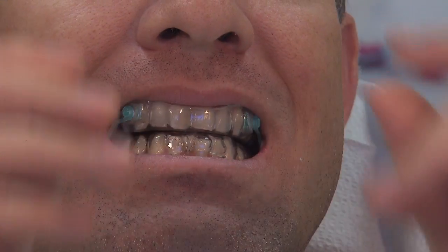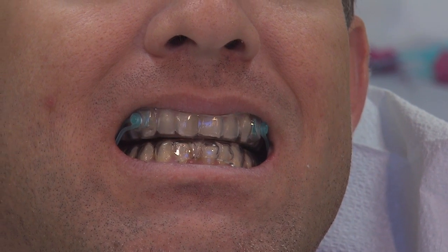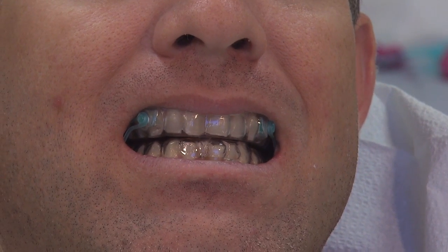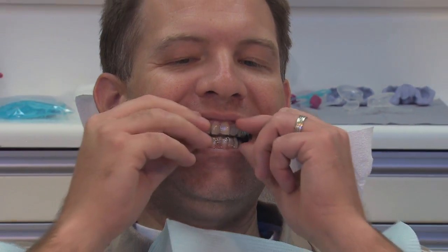And you can see I just have him move back and forth and just kind of showing him the freedom that he's got even when the appliance is in, so he doesn't feel too locked in or too claustrophobic by having this appliance in his mouth. So just want him to see they have some freedom. I will have them take it out at this point so they get used to seeing what it feels like. This is probably going to be the hardest time for them taking it out.